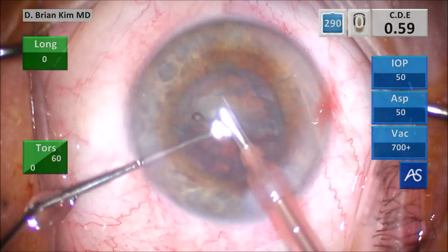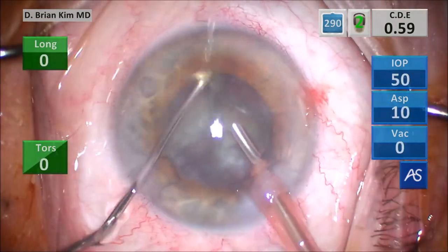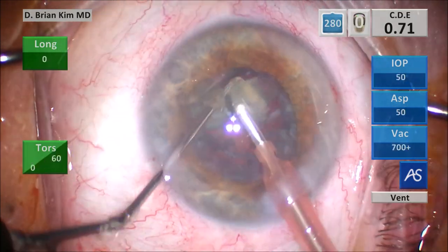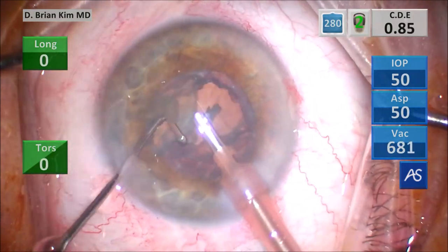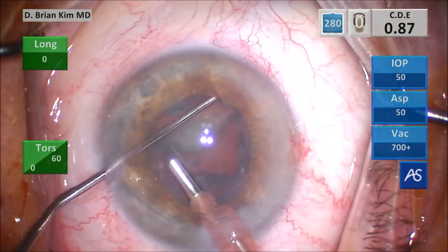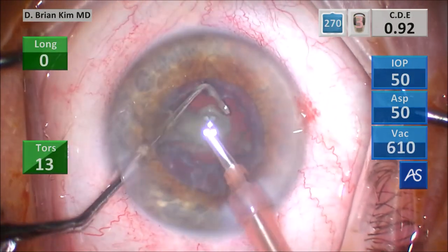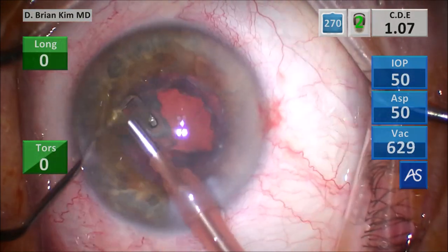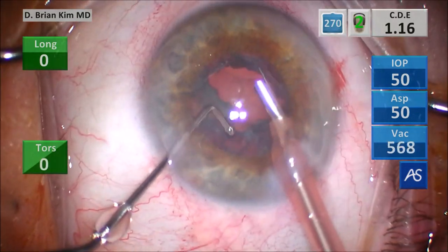I'm going to turn the second heminucleus in front of me, placing the chopper around the lens, placing the phaco tip deep so that it bisects the lens completely, dividing it into two pieces, grabbing the third quadrant and crushing it between the instruments, and then emulsifying the lens pieces. Turning the fourth quadrant around, getting the chopper around it, pulling it centrally towards the phaco tip, bisecting it. Because the crushing force is towards the center, this is very safe on the zonules, and you don't need any additional instruments or devices for this maneuver.